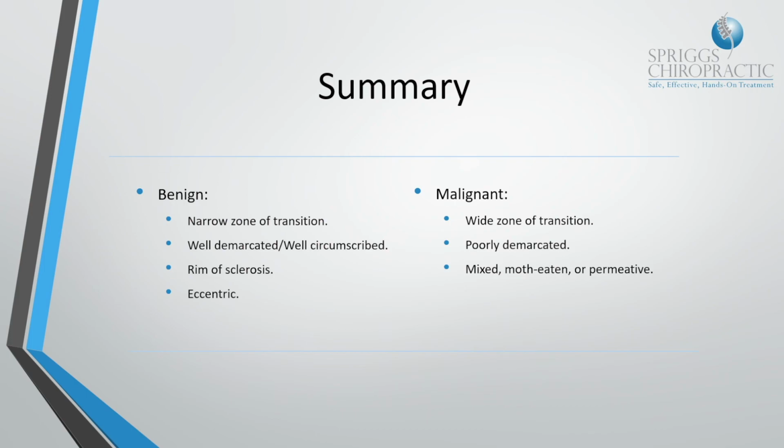Okay, so please use this video as a guide to structure your revision when you're looking at these tumor processes. However, just keep in the back of your mind that there is always going to be a crossover, and this is not 100% consistent across the board for all of these tumor processes.